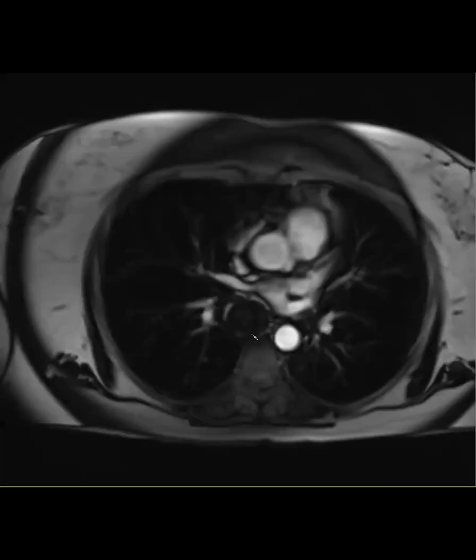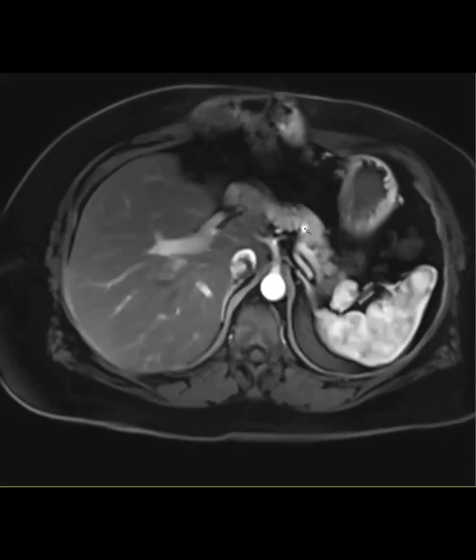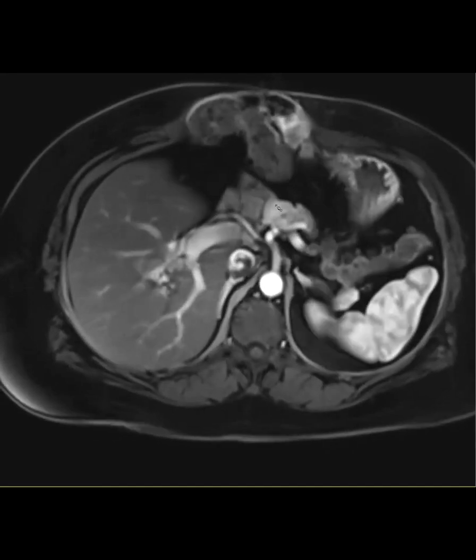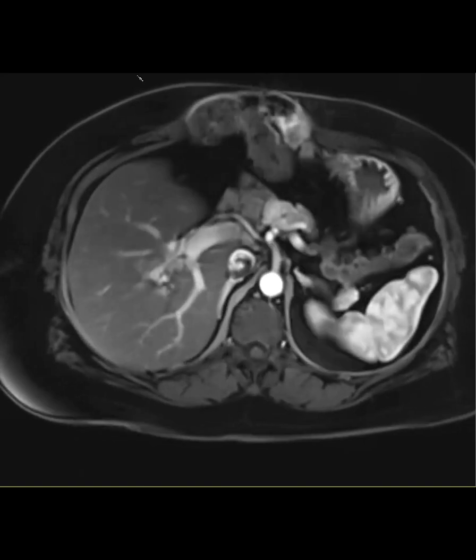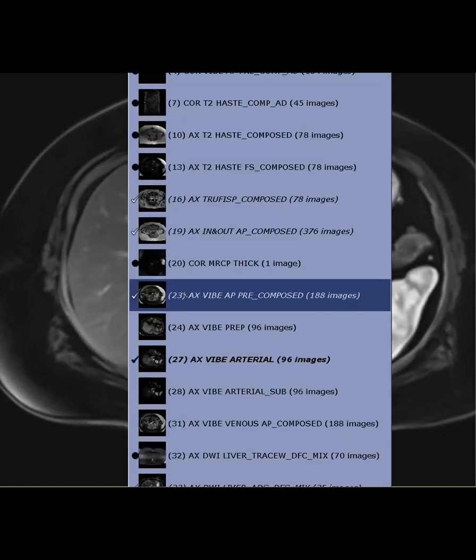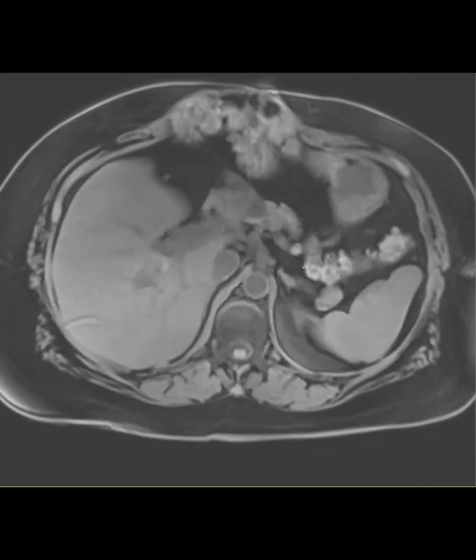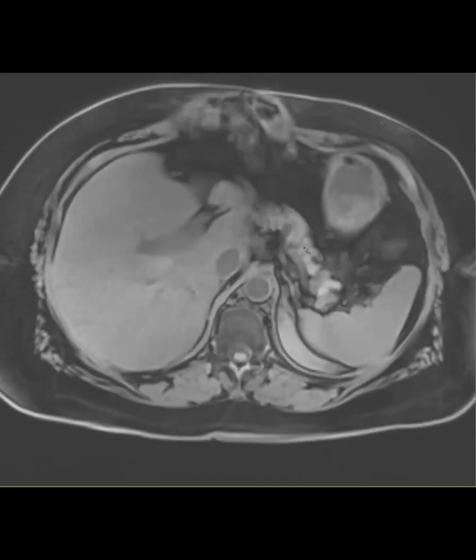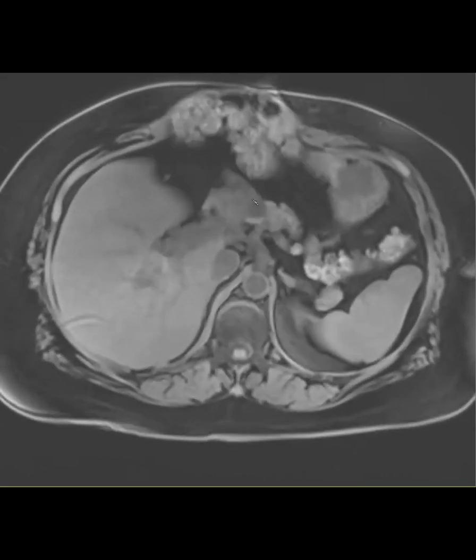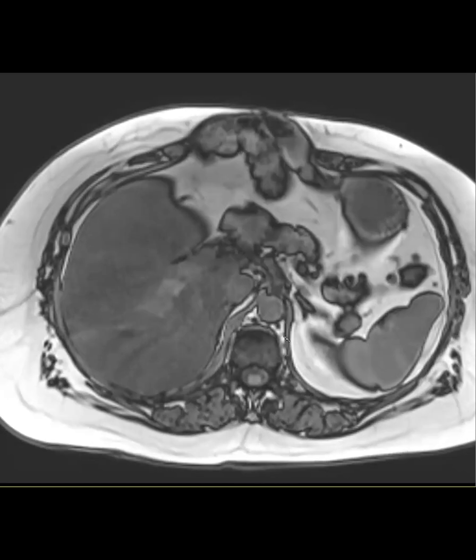So for example, the arterially enhancing RCC met will blend in with the enhancing pancreas. For example, on the post-contrast, it's kind of hard to see here. So one of the phases I find to be most helpful is the pre. I always look at the pre, the diffusion, and the in and outs of the pancreas on any patient who has RCC. And here you can see that the pancreas is nice and bright. And then here is that lesion that is standing out as this dark thing. And then we confirm that there's this thing with intravoxel fat here.